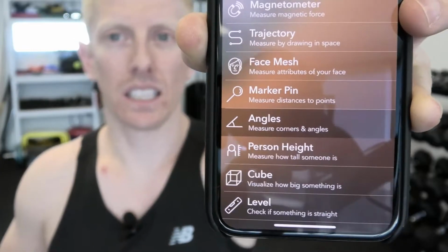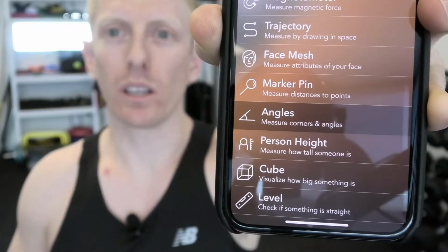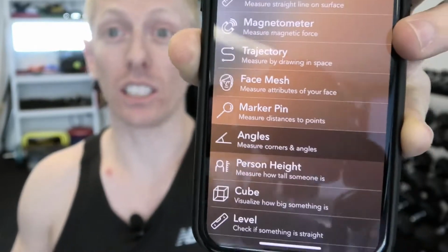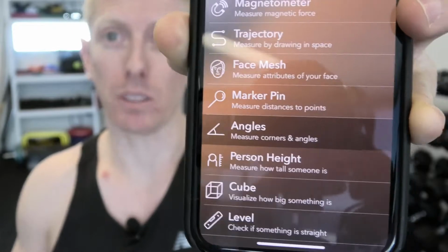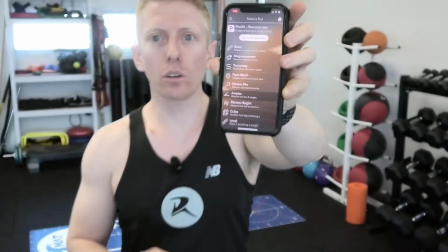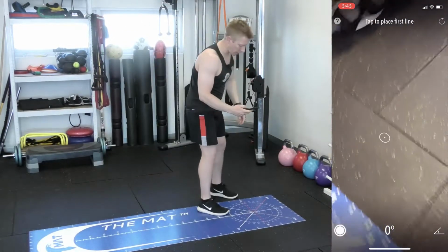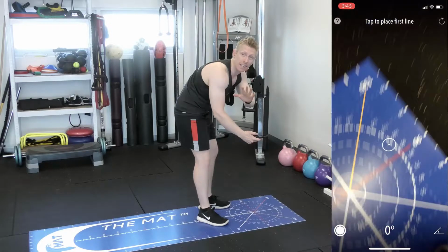Now the last thing I want to show you with augmented reality is the angle measurement. Really useful tool potentially to give us range of motion measurements accurately and reliably using augmented reality. So what I'm going to do, I'm going to select this angle and I'm going to find something which I know is a right angle. So in this case, I'm going to use the mat again, okay?